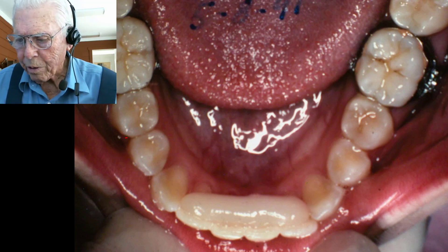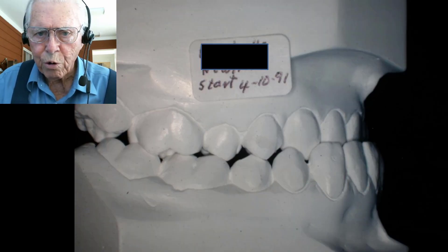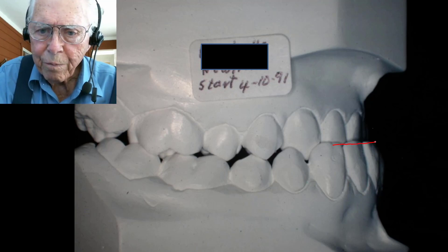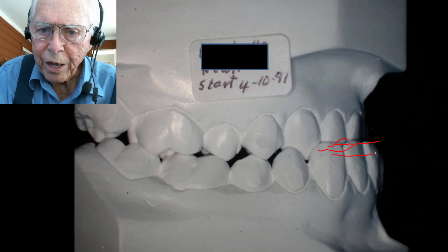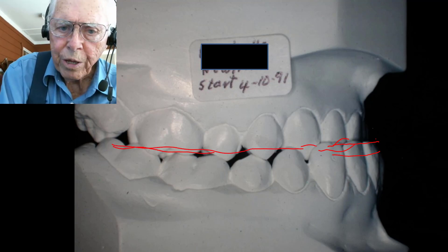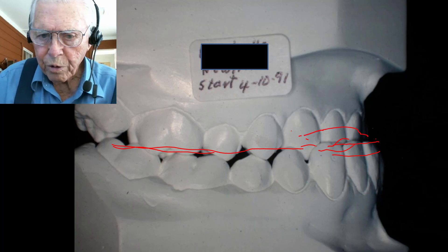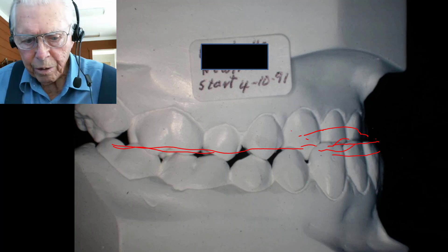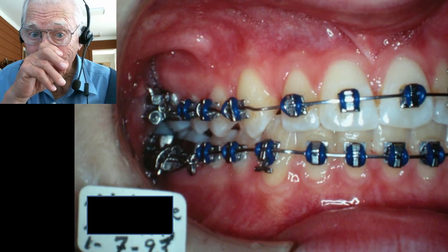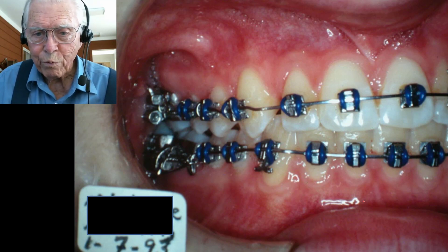Here is where her lower jaw was when we started. We put the acrylic pad on the lingual side of the anterior teeth, she bit on that, and those teeth were not touching at all. We applied spring pressure and shoved the front teeth over the top. This next slide shows more or less where they were when we finished — we got them over and lined everything up.